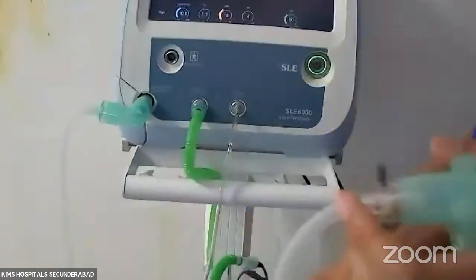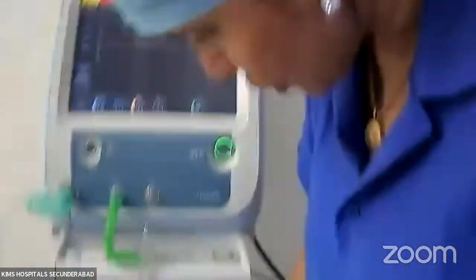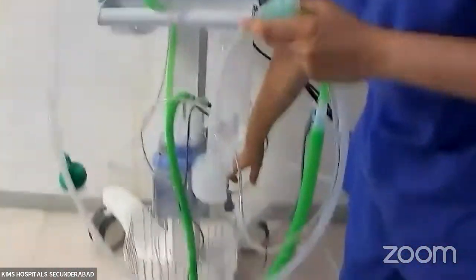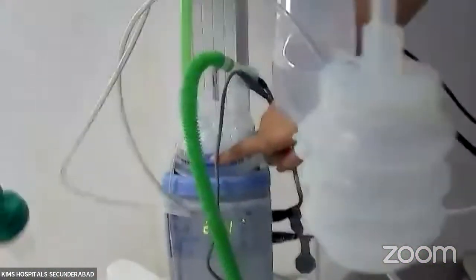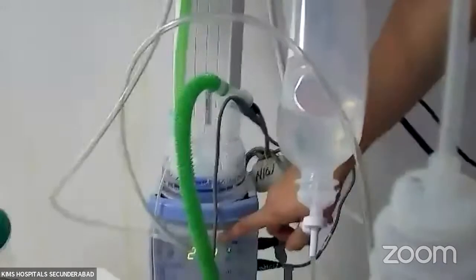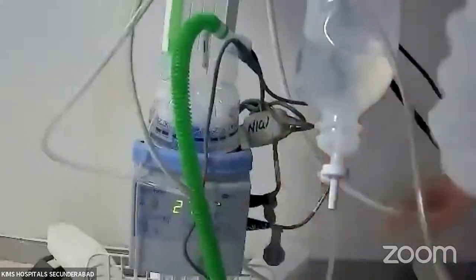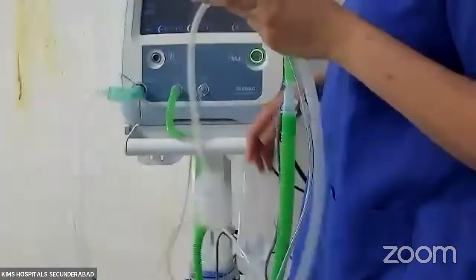The small compressible volumes are possible with the specially designed circuits for high frequency. So once you connect the circuit, make sure that you have switched on humidification. Since we have just switched it on, the temperature is rising now. The water level should always be filled until the black line. The temperature, once it attains the optimal temperature, should be at 37 degrees Celsius. And one should not see any condensation along the inspiratory circuit. You may see condensation in the expiratory circuit.